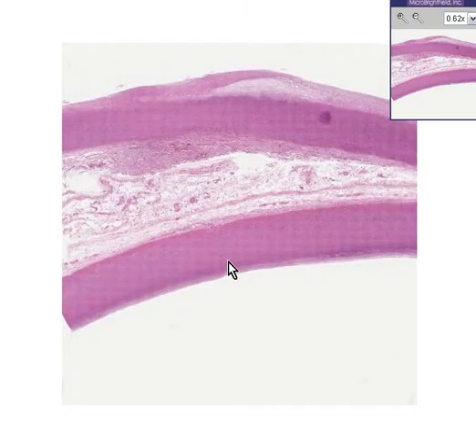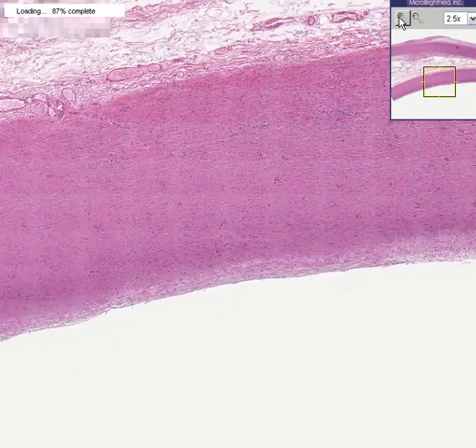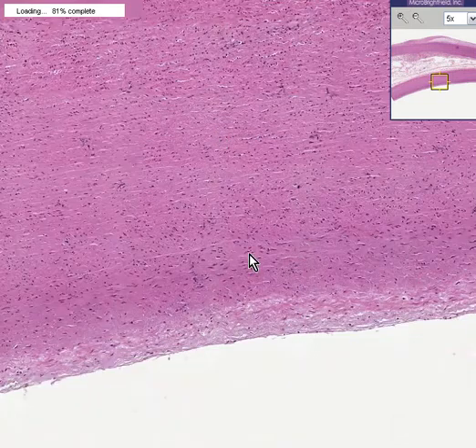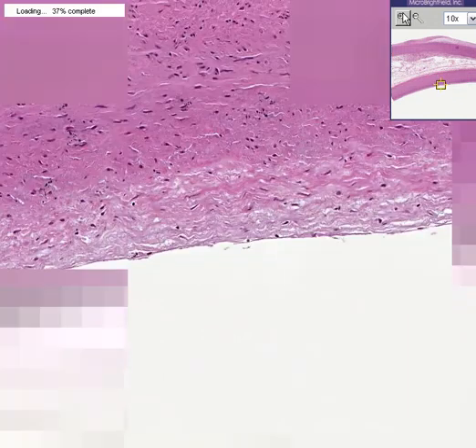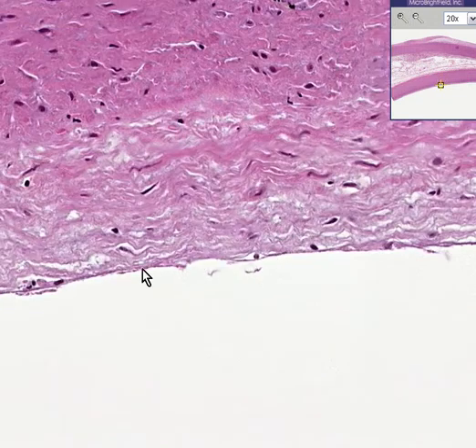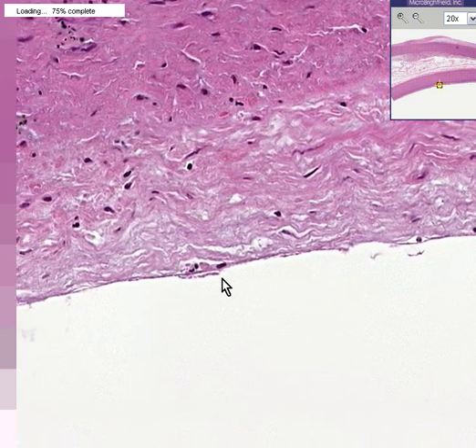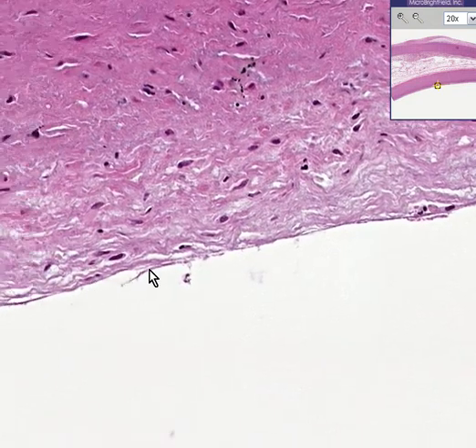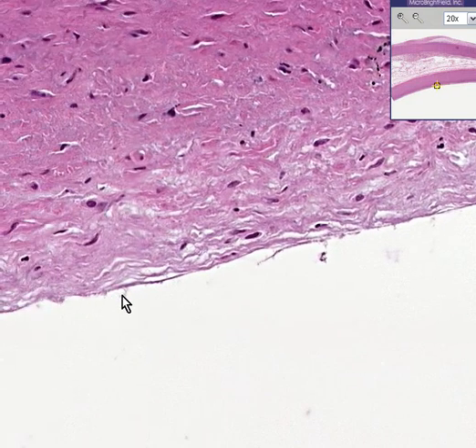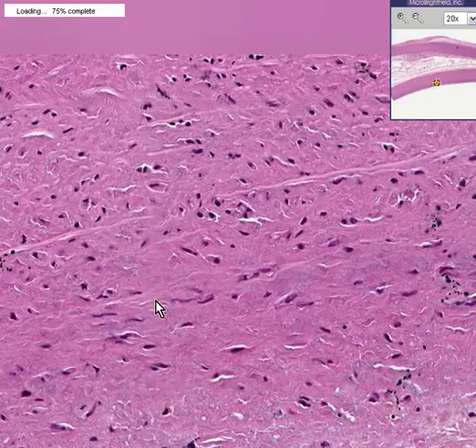We're looking at that same aorta now, only now microscopically. And even though this is the very largest blood vessel of your body, the intimal or luminal surface is basically the same as any capillary. It is lined by a single endothelial cell, which we're lucky enough to see probably here. Oh, maybe here. You'll see the nucleus of an endothelial cell. And this is a fairly normal wall then of the aorta.